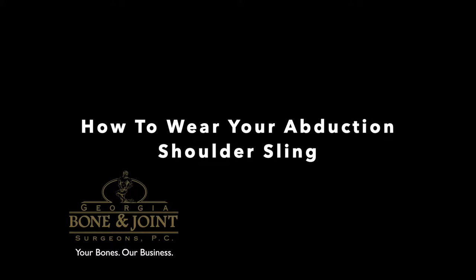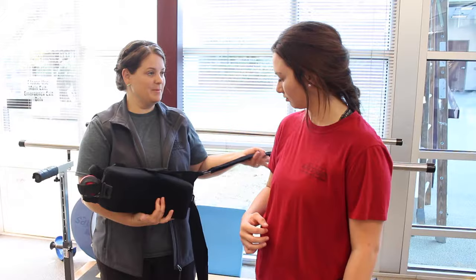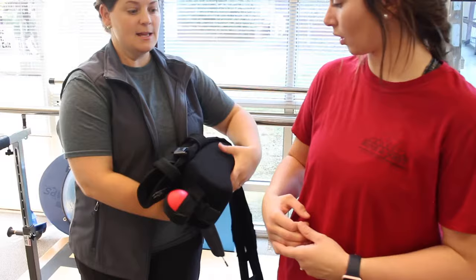I'm Abbey with Georgia Bone and Joint Surgeons, talking with you today about how to make sure your shoulder sling fits correctly. In this video we are using a regular shoulder sling with an abduction pillow attached. This type of sling is prescribed after certain shoulder surgeries because it allows your shoulder to relax in a fixed position after your surgery.